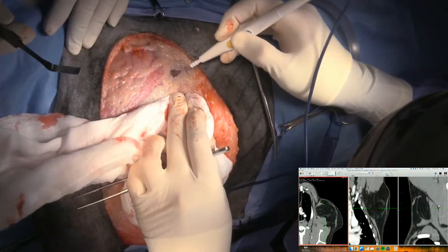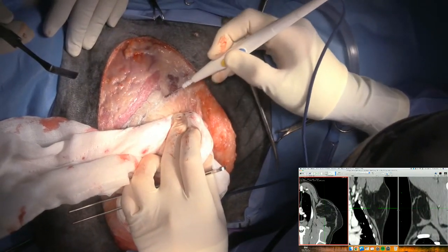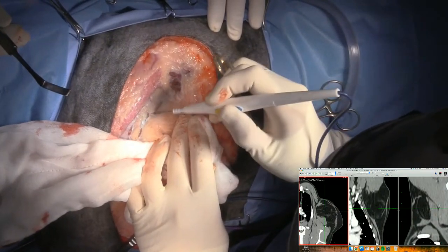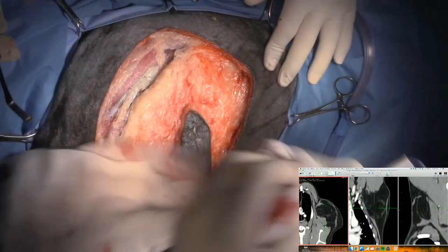CT scan is so helpful here in determining where it's coming from, and it's something that you could do on an exploratory, but I'd be afraid that you'd miss it.